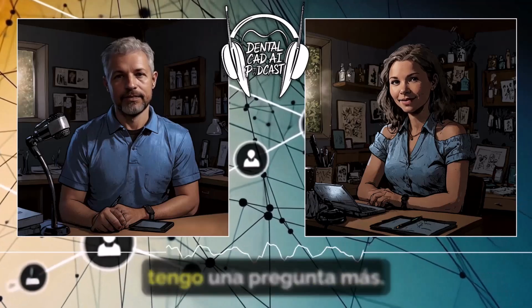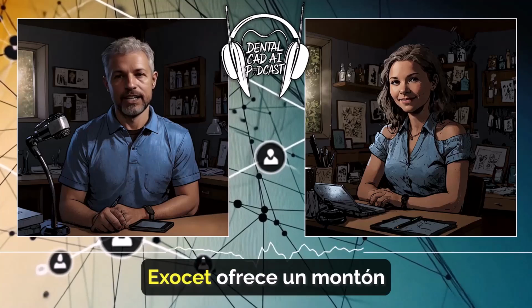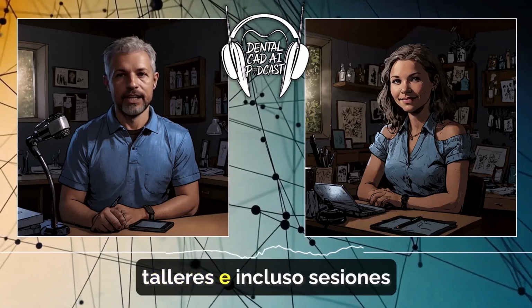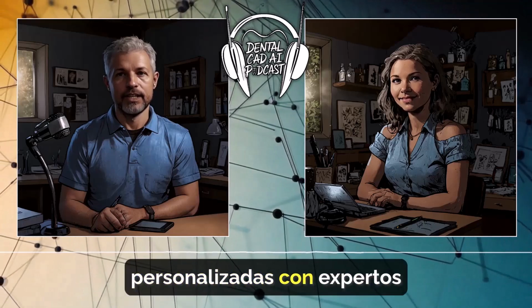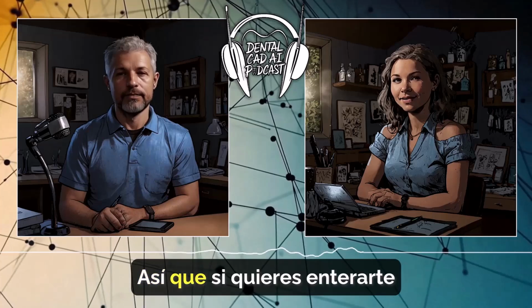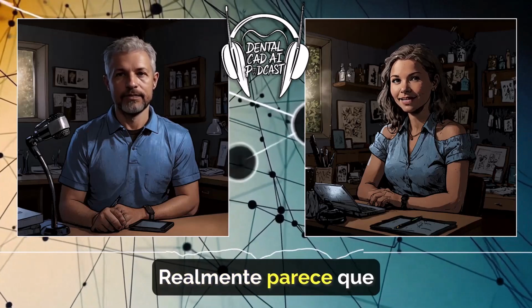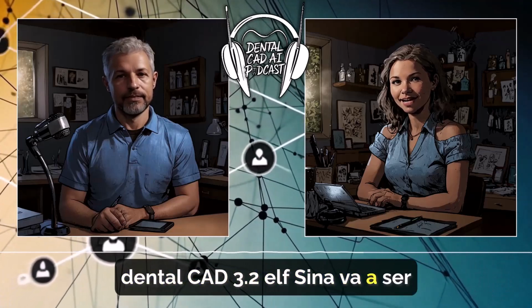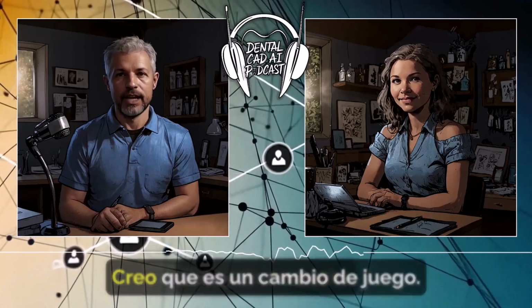Okay, so before we wrap up, I have one more question. Where can people go if they want to learn more about all this? Well, CAD offers a ton of resources. They've got online tutorials, in-person workshops, even personalized online training sessions with CAD experts. So if you want to really geek out on all the details, you can. Absolutely. It really seems like this software, DentalCAD 3.2 Elefsina, is going to be a major player in the future of digital dentistry. I agree. I think it's a game changer.